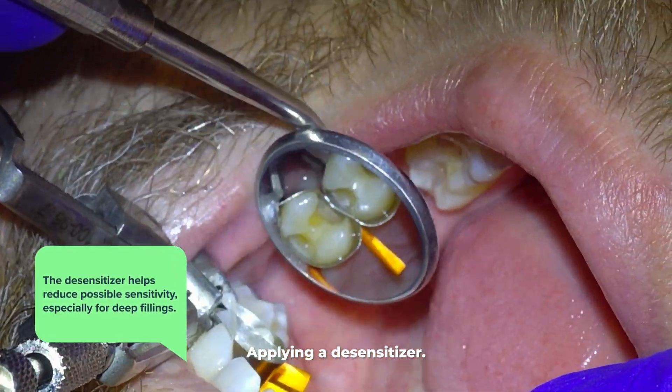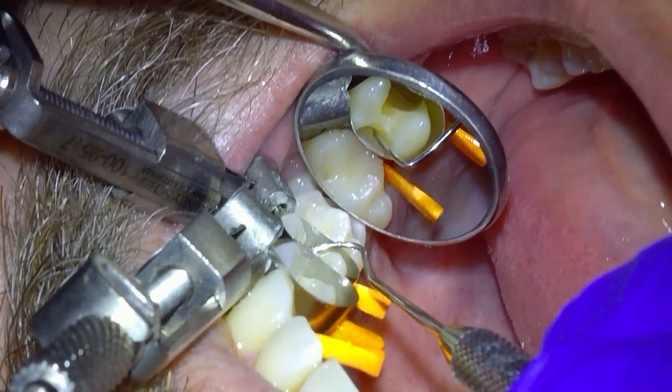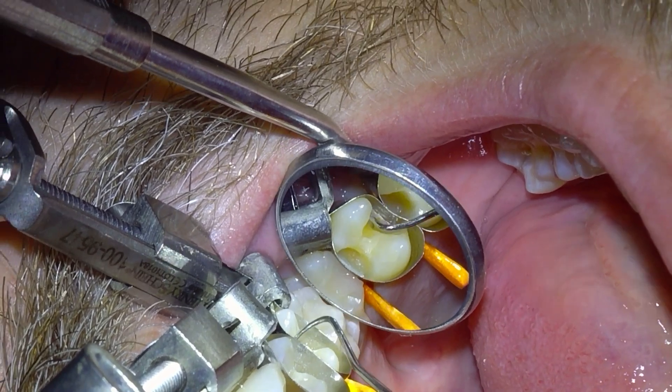After I put the desensitizer on, I do one last quick check with the explorer for decay again, because I'm pretty paranoid about that.